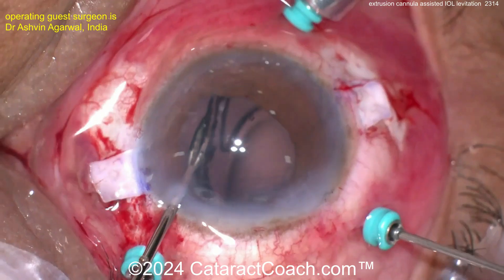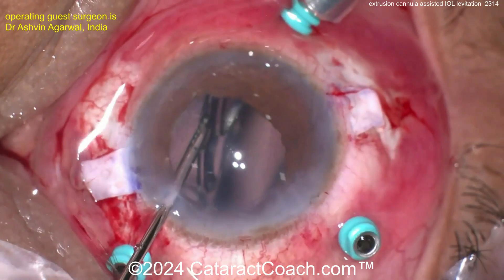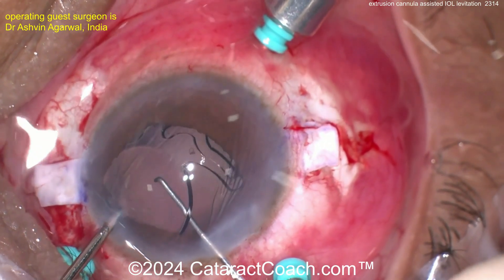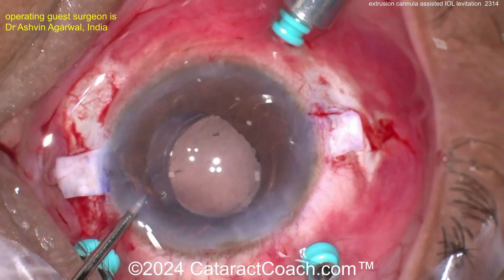There's the extrusion cannula — look at that — holding on to the lens. Once you bring it up, grab it with some forceps. Get that lens up into the anterior chamber, and then you can bring it out of the eye.